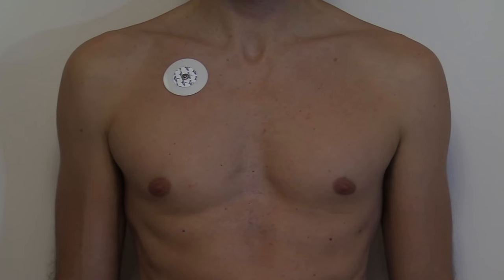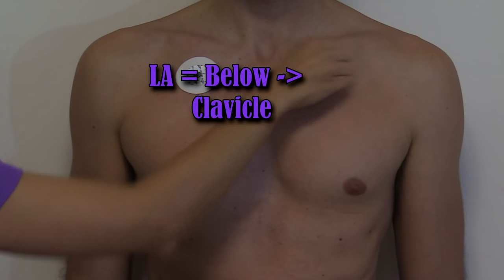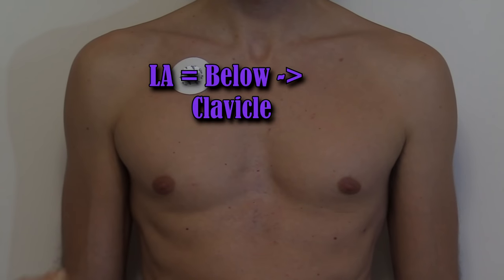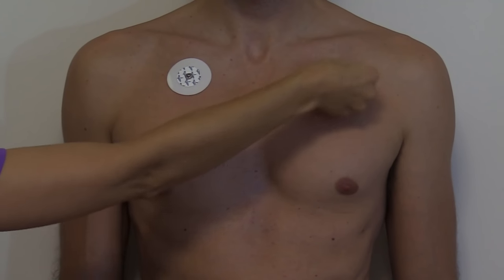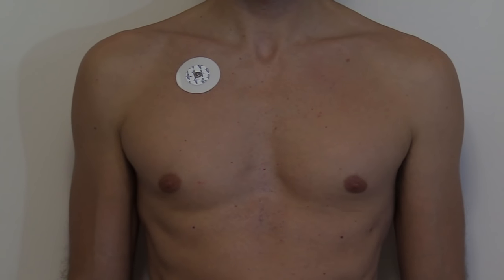Now we're going to put our left arm. You're going to do the same prep — cleanse the skin with alcohol prep, rough it up — and we're going to run below that left clavicle and then place our electrode.